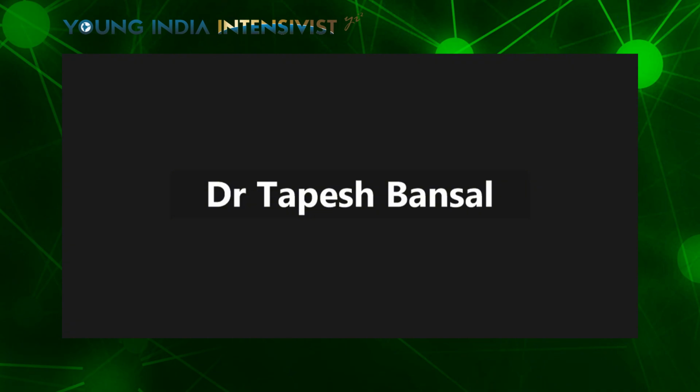Initially it was thought that perfusion would change when you make the patient prone, but the perfusion remains more in the dorsal area. So are we able to explain that any further? Because there was no explanation to that at least a year ago, as far as I know. And there were papers from Gattinoni's group, sir. And what is your take on this now?